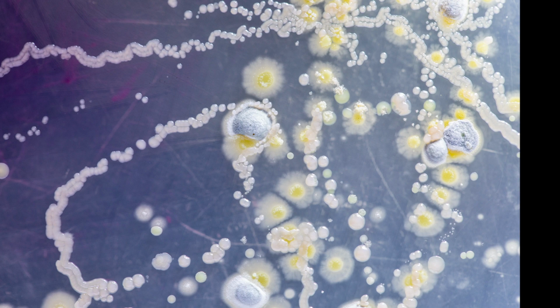So after our discussion, everyone could go back in the lab and look at the plates again. That's also, if it's possible, a very good way to do it, to keep the plates so that people can go back and reread after a discussion, or look at the fuzzy or sharp zonage and see if they understand and agree that this is how to read this zone.